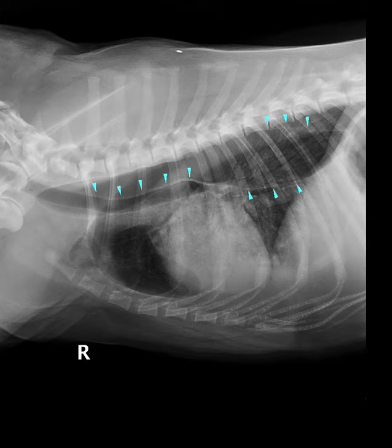The next steps will include treating for pneumonia, of course, and a medical workup to determine the underlying cause of megaesophagus. This might include screening for infectious disease, endocrine pathology, myasthenia gravis. Often esophageal motility studies such as an esophagram could also be helpful, and potentially endoscopy to have a complementary assessment of the luminal pathology such as concurrent esophagitis. So be sure to review the full report associated with this case.